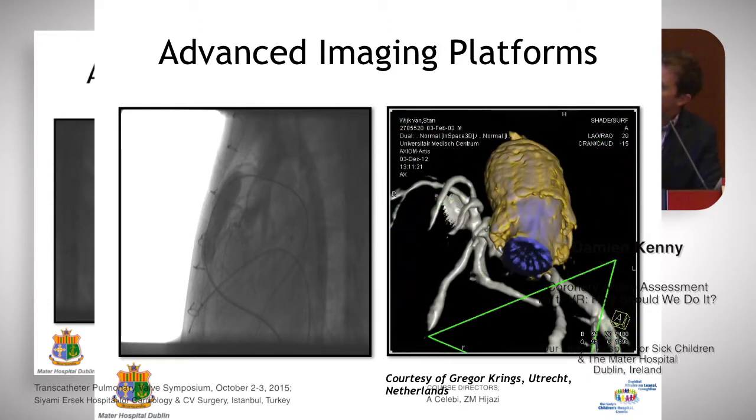And you can see again, as we pan backwards and forwards, it allows us to evaluate it, and then when we tilt it into that view, it suggests that actually the coronary is reasonably remote, and therefore I think they decided to go ahead and put a valve in a little bit lower down again in this patient to avoid any issue with the coronary artery compression.